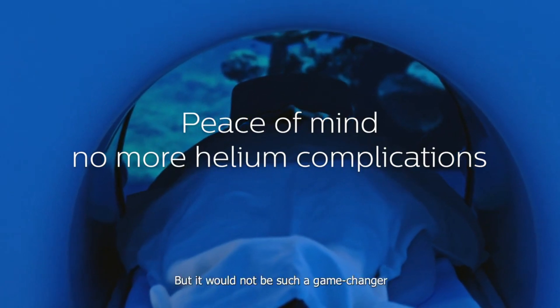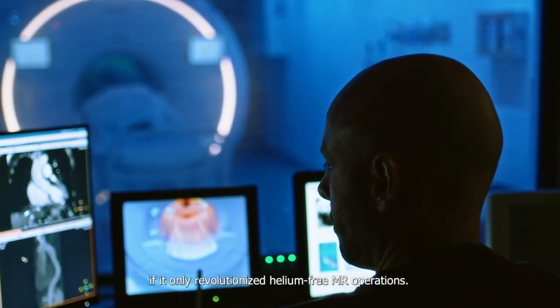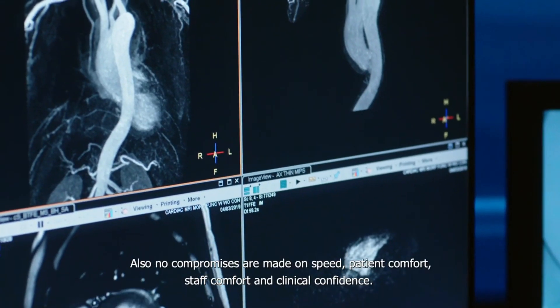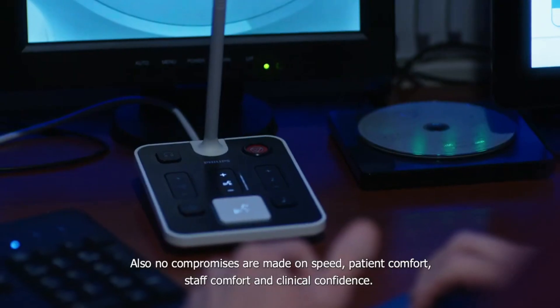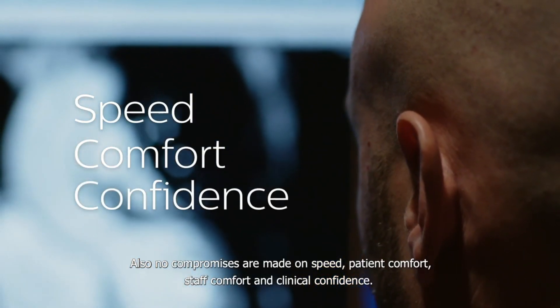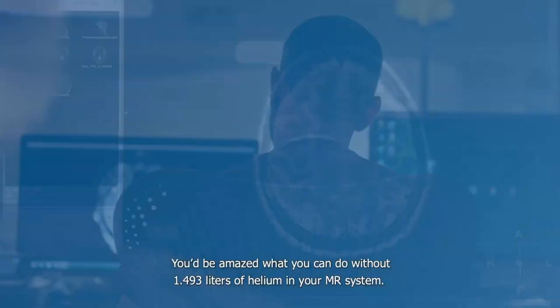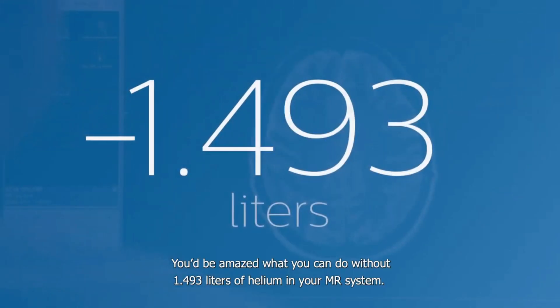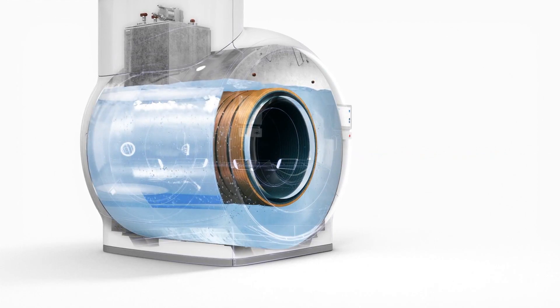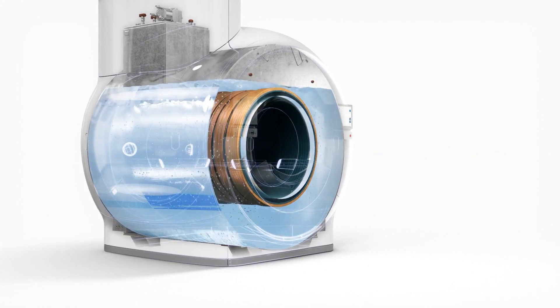Magnets with freelium technology are designed to be less dependent on helium, much easier to site, and eco-friendly. Thanks to freelium technology, hospitals would no longer need extensive venting that often necessitates sitting a magnet in a separate building or newly constructed room. Additionally, a freelium magnet would not need any refilling during transportation nor throughout its lifetime.